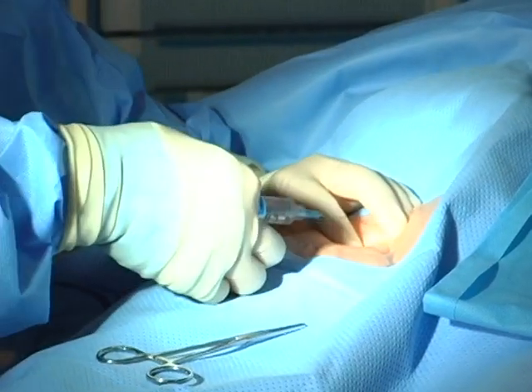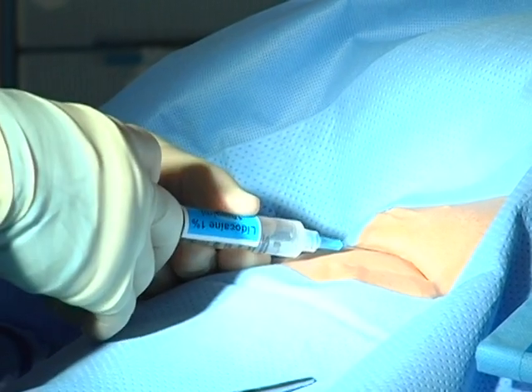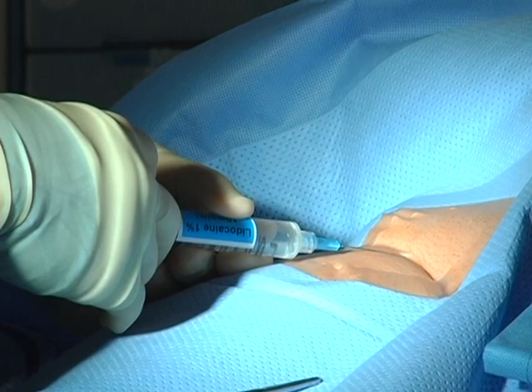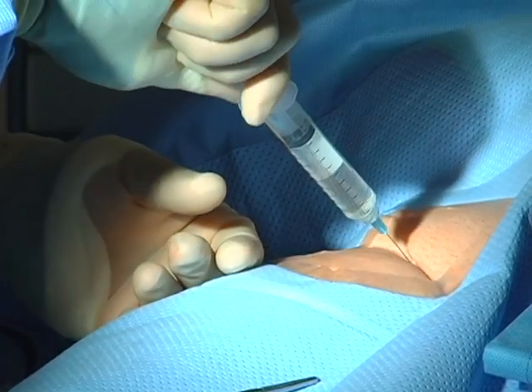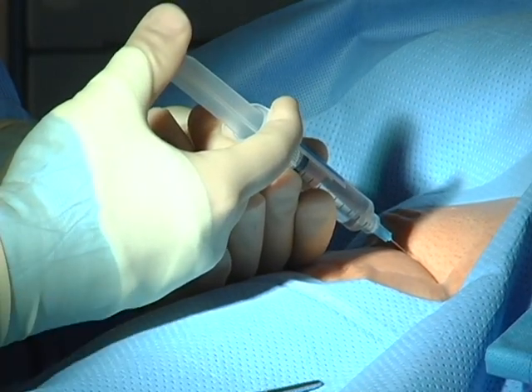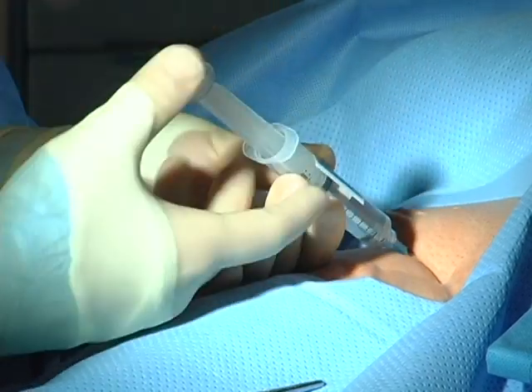A superficial skin bleb so the needle doesn't hurt. Then he'll go down alongside the artery on the medial aspect and along the lateral aspect and deliver about 10 to 15 cc's of the lidocaine 1% mix. After that, we'll be using the typical Seldinger needle.